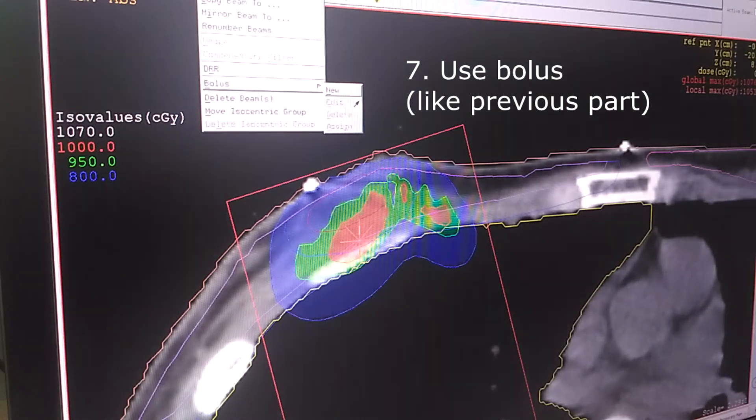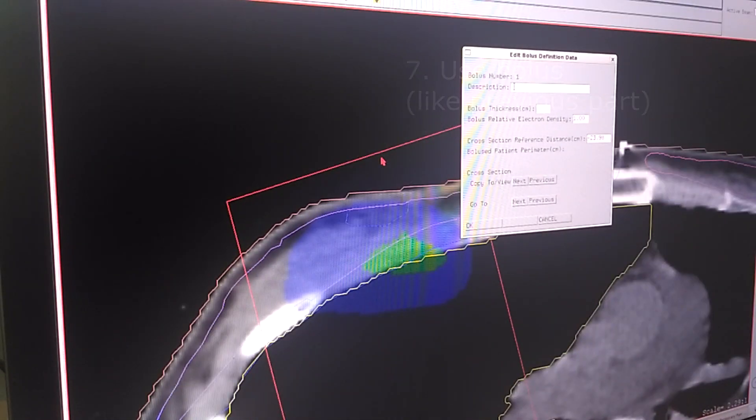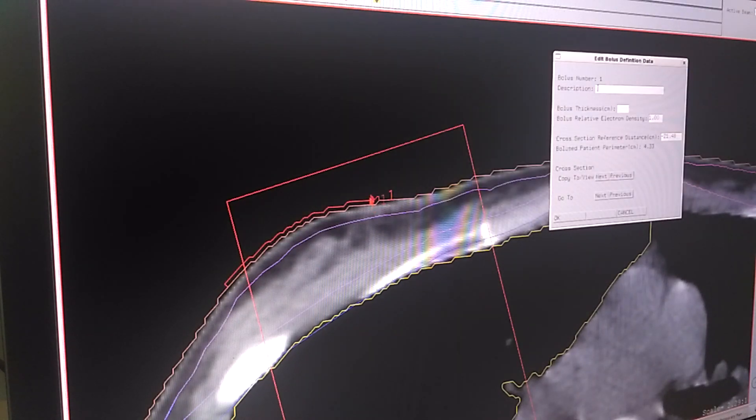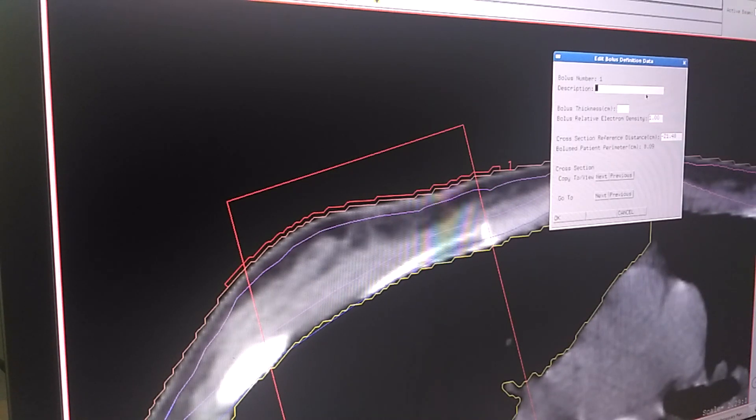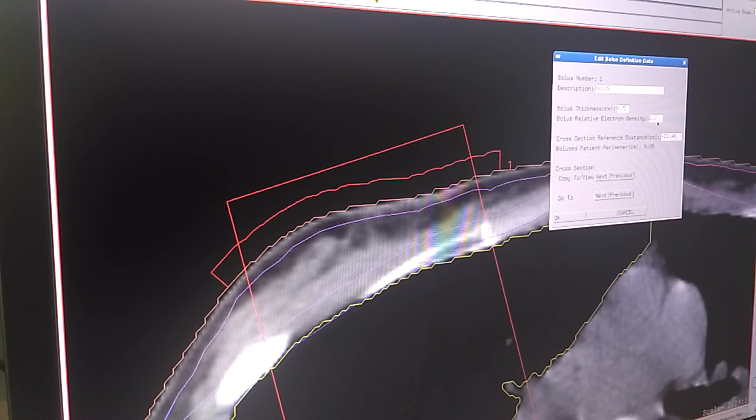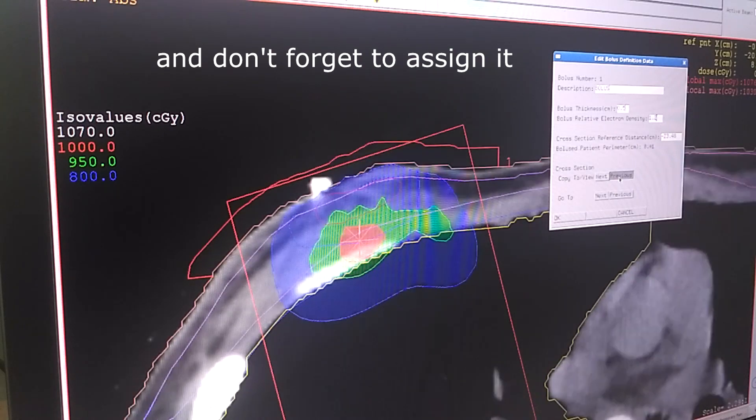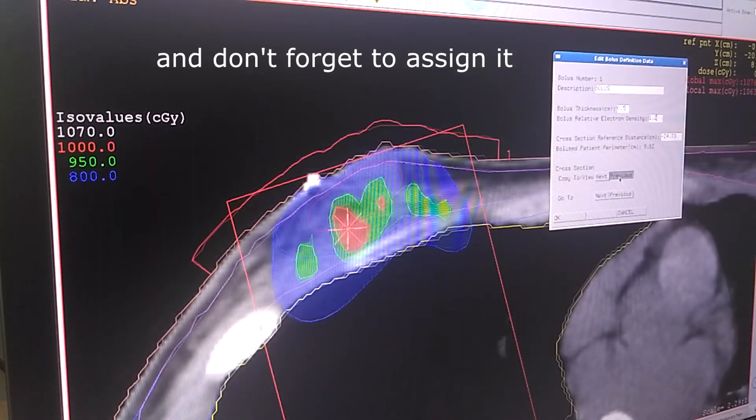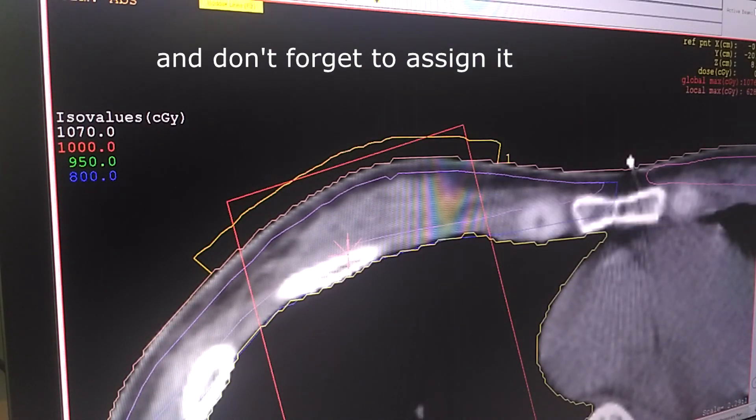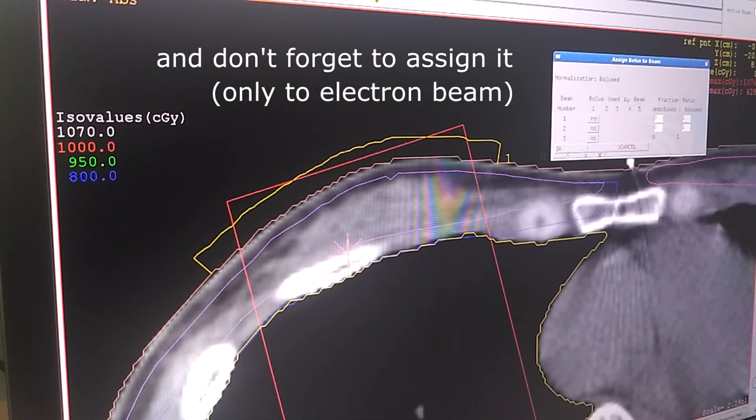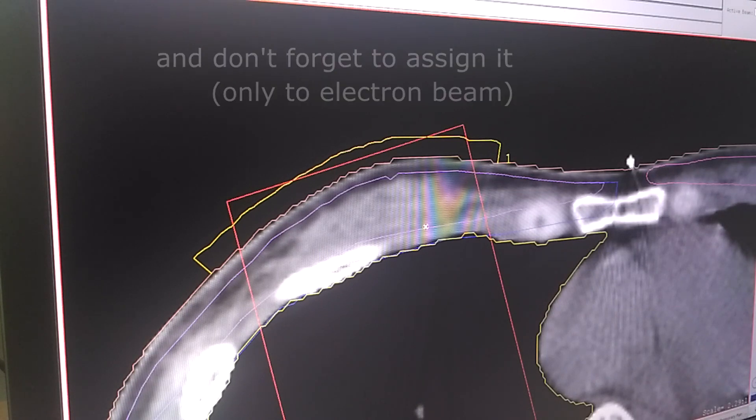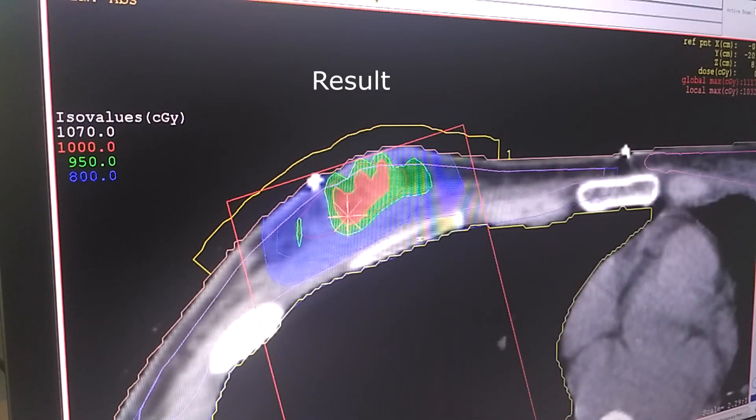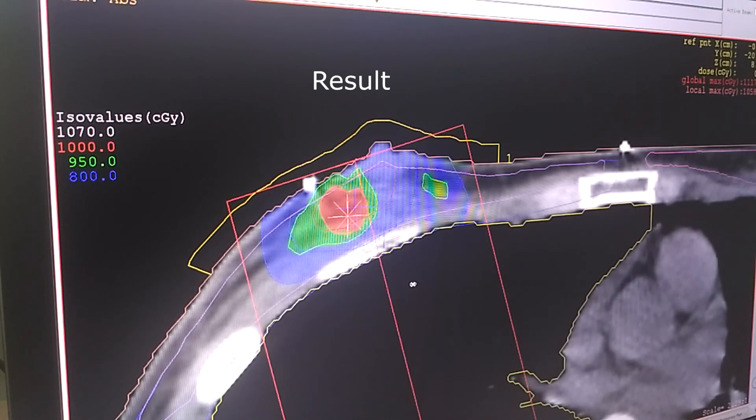I'm going to make bolus just like previous video. I'm going to try 5 millimeter. It's done and then I'm going to assign it into the electron beam. Click OK. We can see the dose is already going upper into the skin so it's not in the lung again just like before, so it's good.